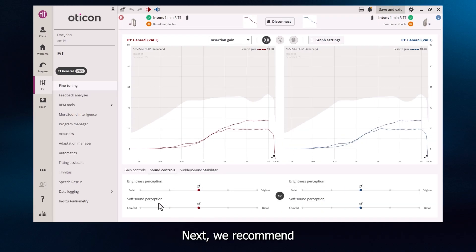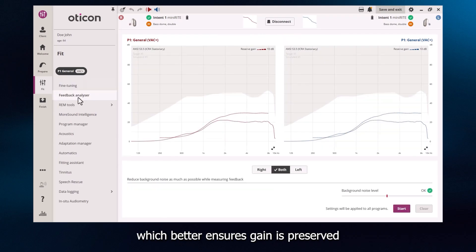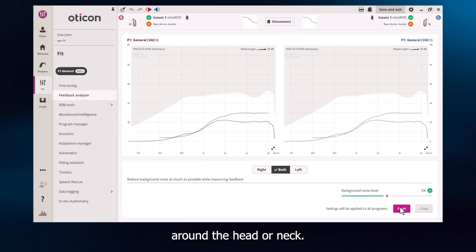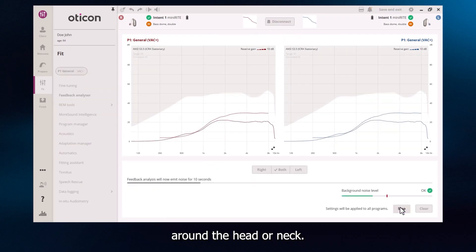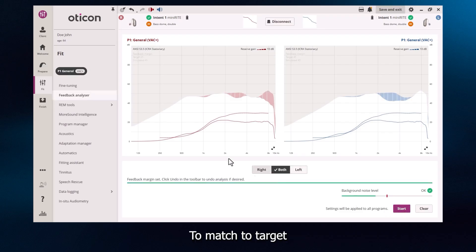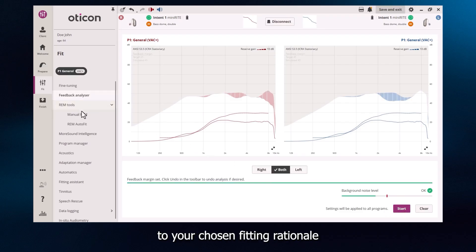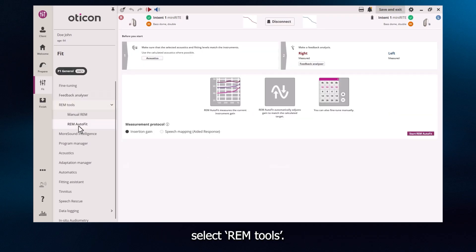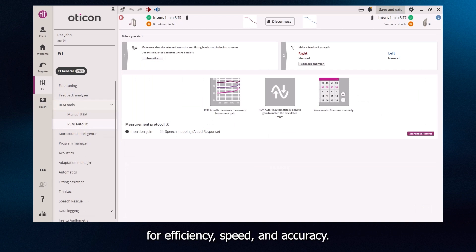Next, we recommend running Feedback Analyzer, which better ensures gain is preserved even when there is movement around the head or neck. To match to target to your chosen fitting rationale using real ear measurements, select REM tools. We recommend REM Autofit for efficiency, speed and accuracy.